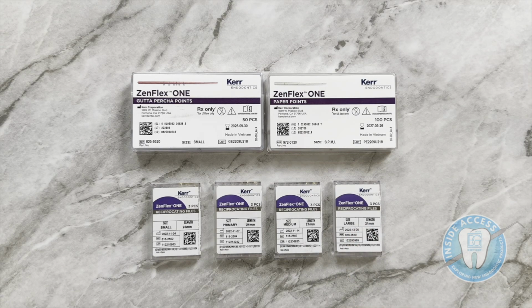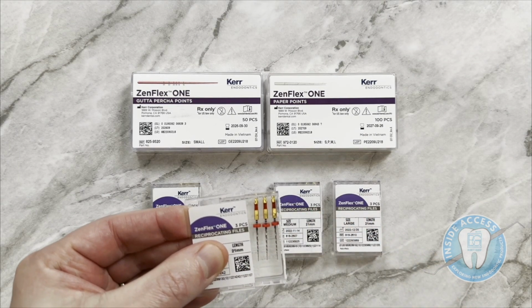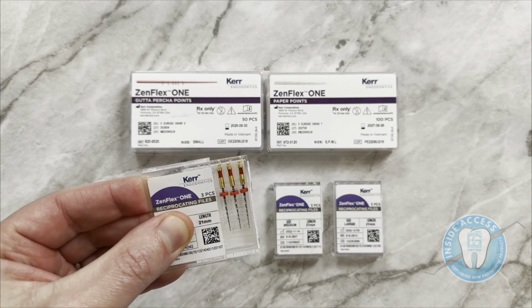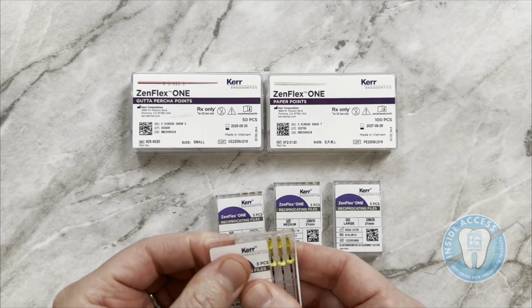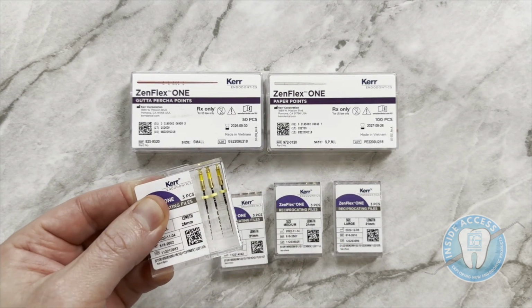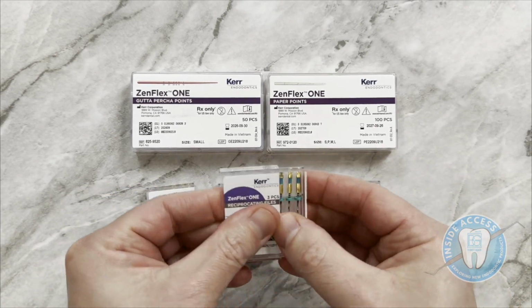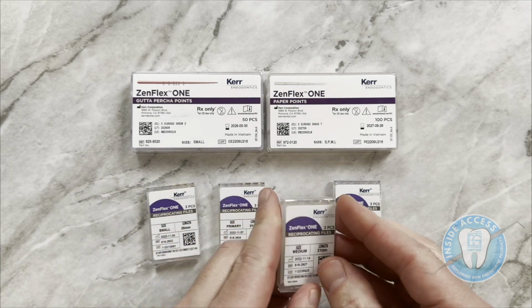So again, when you look at the primary file, which is going to be the workhorse of the system, again, it's marked with the red stopper as you might be used to. If you've used a system in reciprocation before, you have the yellow, you have the red. Obviously, when you come down into ISO sizing, green standing for the 35, and then ultimately white is going to be your large.